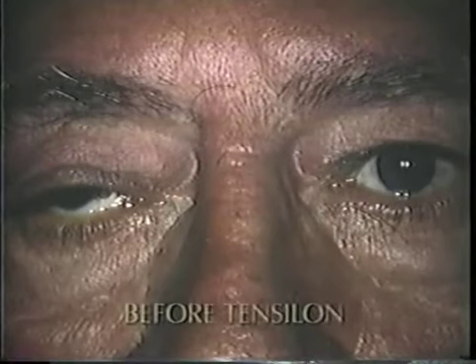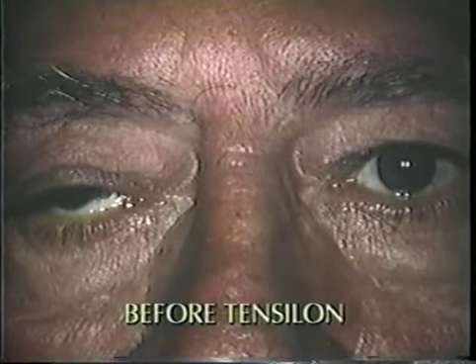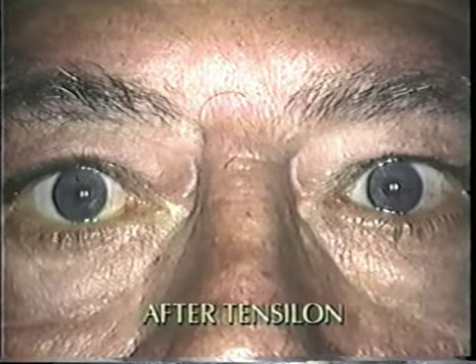Hold the rod in front of one eye and have the patient view the red line and white light. As alignment improves, the patient indicates that the line and light appear closer together. There are a variety of methods other than the Maddox rod test to assess alignment during tensilon testing. Whatever method is used, it is crucial to perform it quickly since tensilon is a very short-acting agent. With tensilon testing in myasthenia gravis, eyelid changes are often much more dramatic than changes in strabismus.